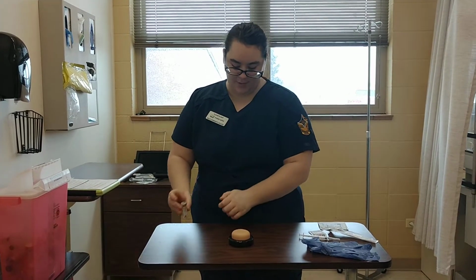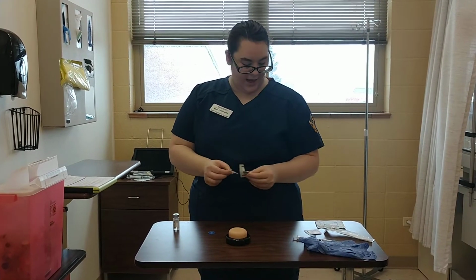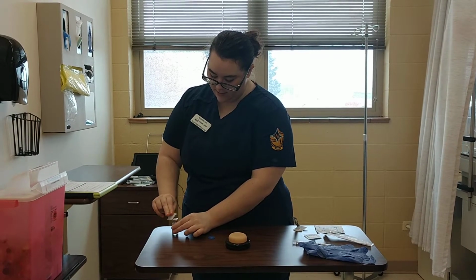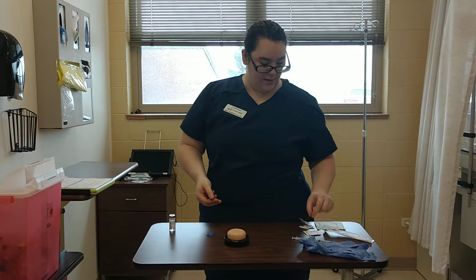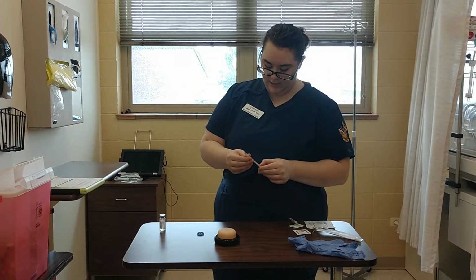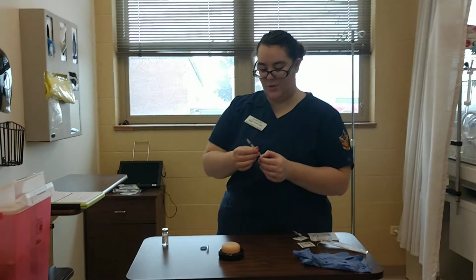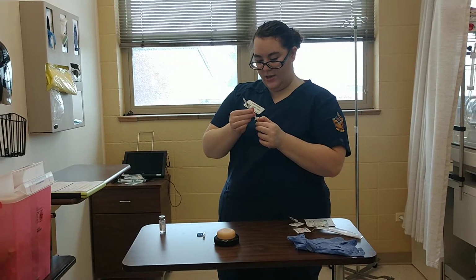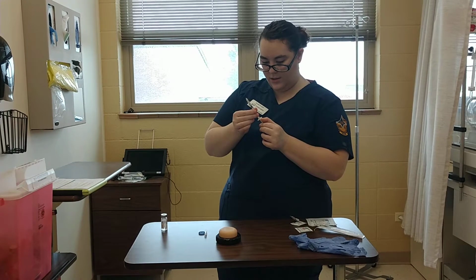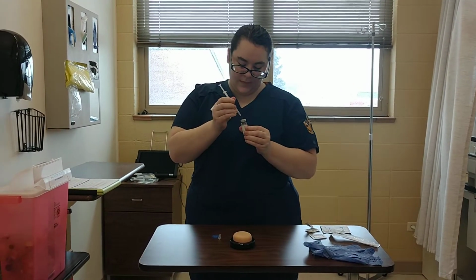Okay. I'm going to uncap it. I'm going to clean it with an alcohol swab. I am going to pull air into my needle equal to the amount of medication that I'm withdrawing. I'm going to do 0.3 milliliters of medication, and I'm going to inject the air into my medication vial.